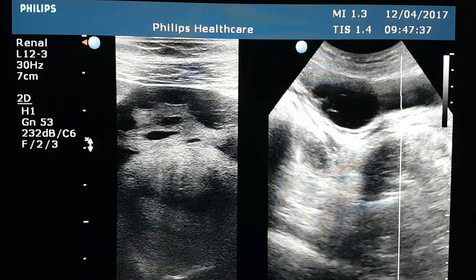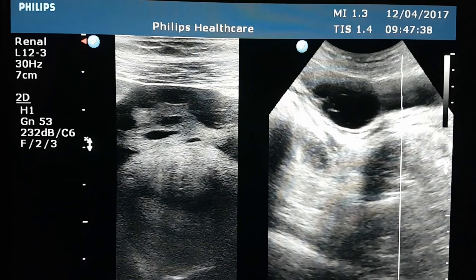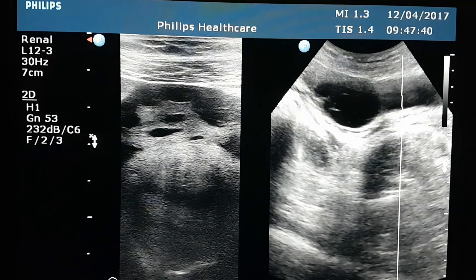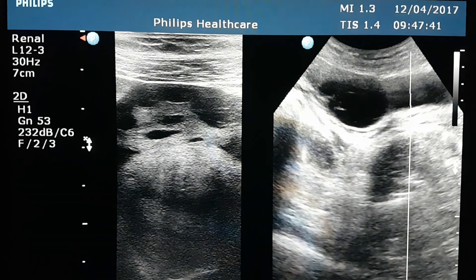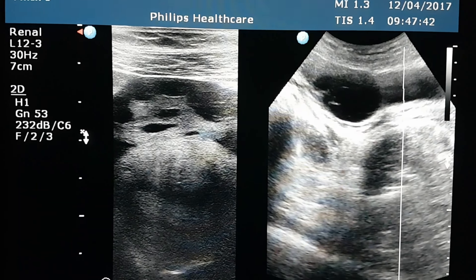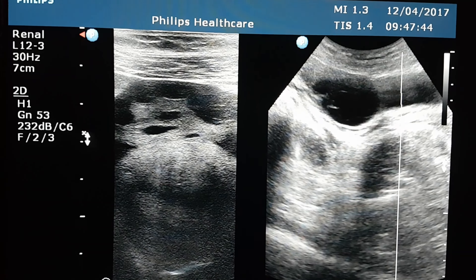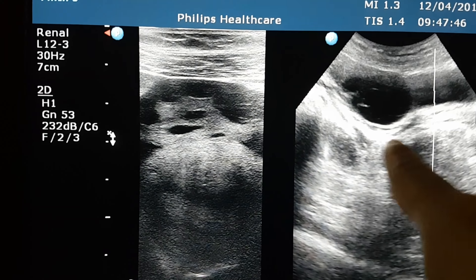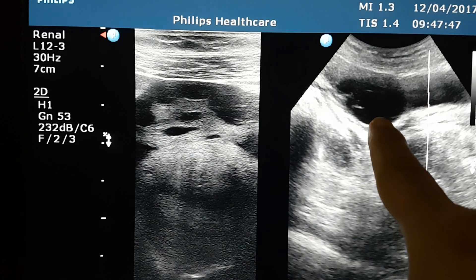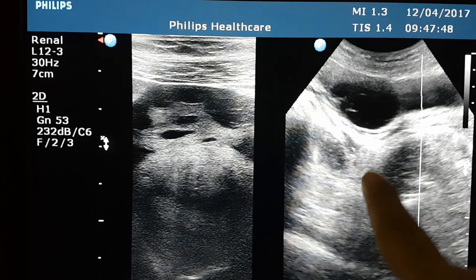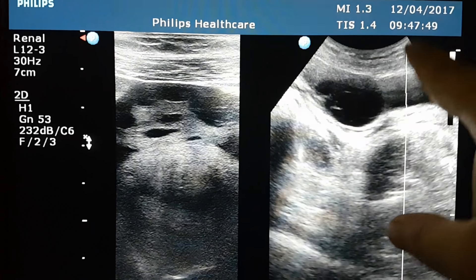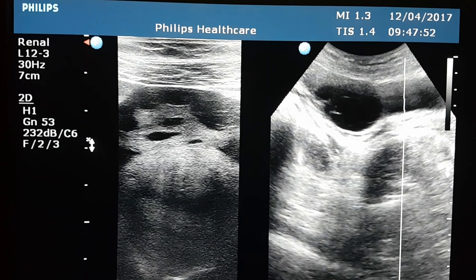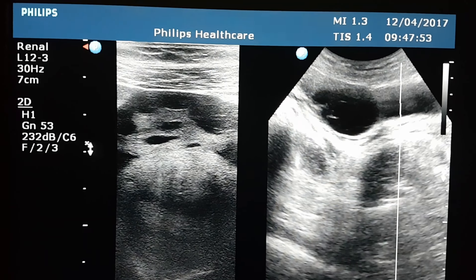Young female suspected for appendicitis. Normal appendix scan excludes inflamed appendix. The right adnexa is examined by convex probe, and a cyst is seen.